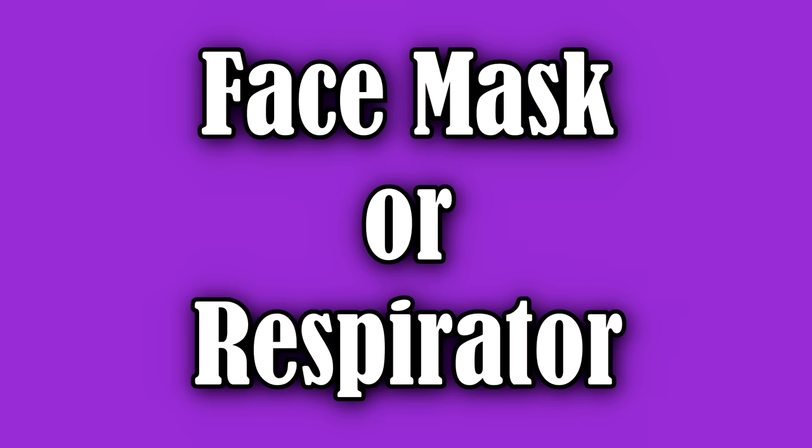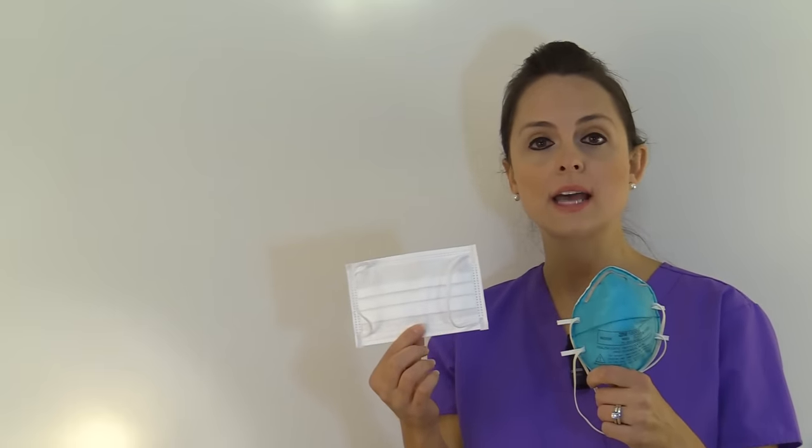Next, a face mask or respirator. You will select either a face mask, which you will wear at all times if a patient is in droplet precautions, or if you're going to be doing something where there's a risk of getting splashed in your mucous membranes. Or you may wear a respirator — an N95 mask — which is worn at all times when a patient is in airborne precautions.